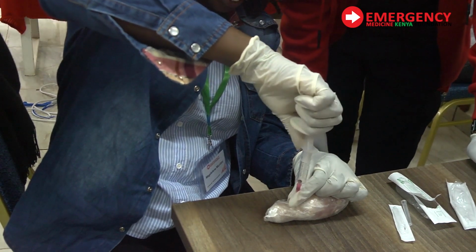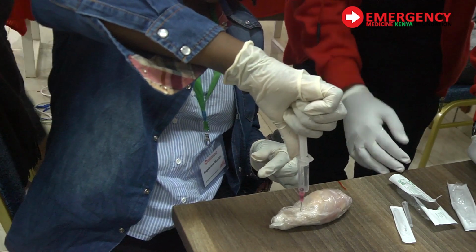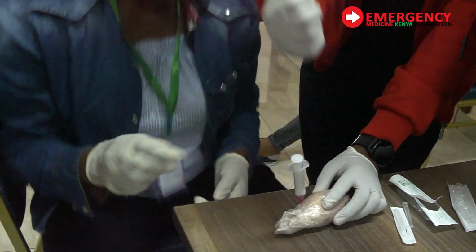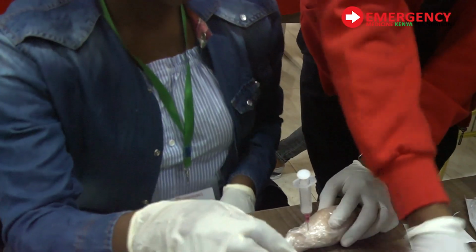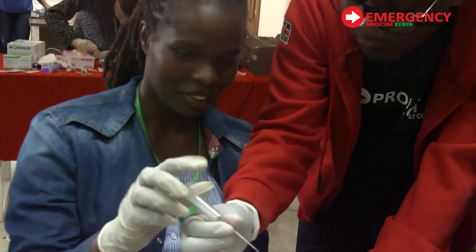Medial malleolus. You can also do, didn't I say, proximal tibia, distal tibia, distal femur. Clavicle, sternum, head of humerus, iliac crest. So you can go through all those sides.